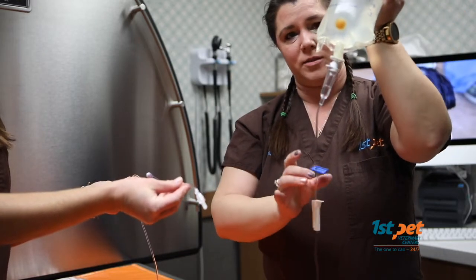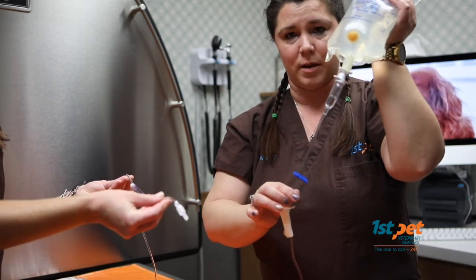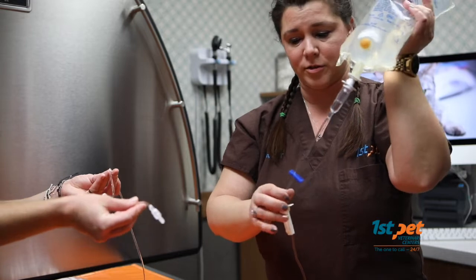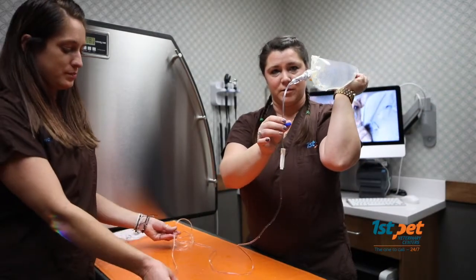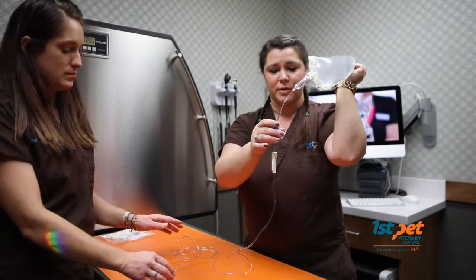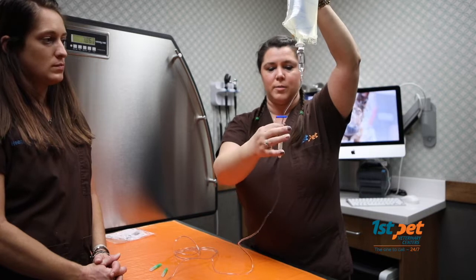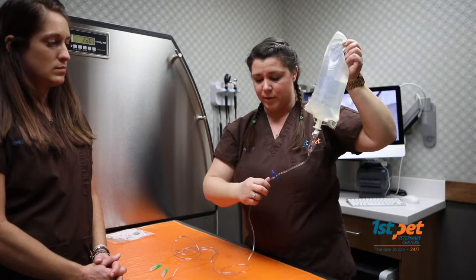These are just two things to remember about when troubleshooting any issues you're having with sub-Q fluid administration to your patients. You don't have to use both of the clamps. You can if you would like to, if that gives you better ease of control for when you're administering fluids to your pet at home. Just choose to use one or the other, whatever one you are more comfortable with doing.